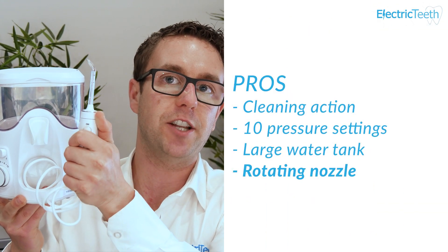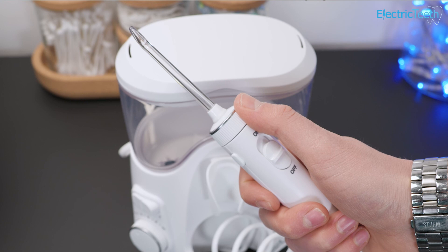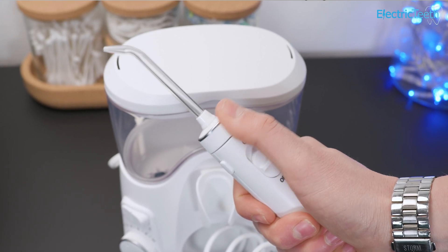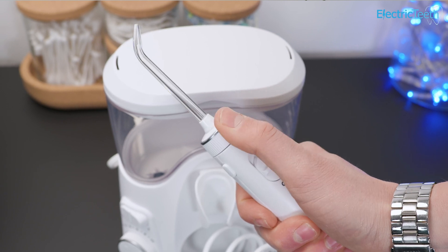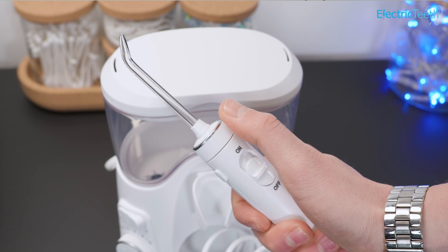Another pro is the rotating nozzle — it rotates a full 360 degrees and is really easy to use. You just use your thumb or index finger to rotate the upper part of the handle, and that moves around in a circular motion. You can move in very finite levels of control or give a much more sweeping action to move to a greater angle, which is really nice when you're cleaning in between the teeth and along the gum line.